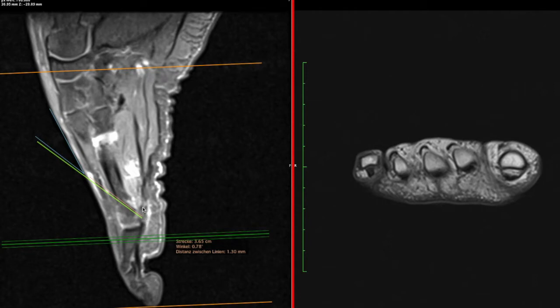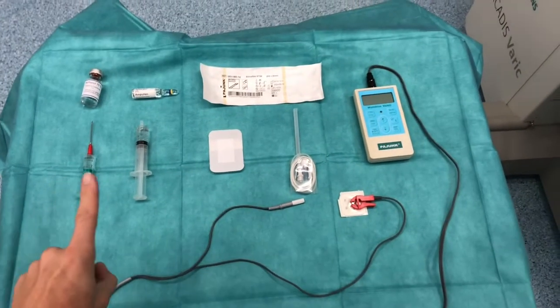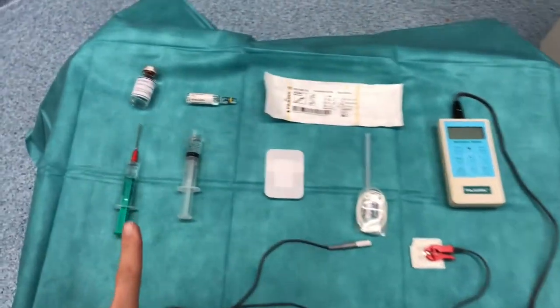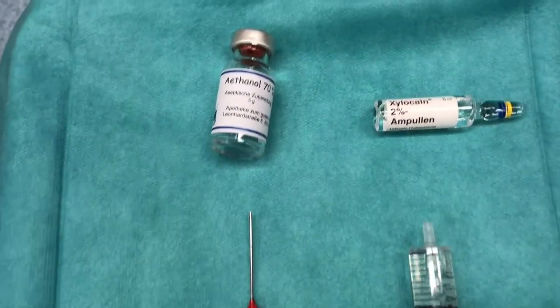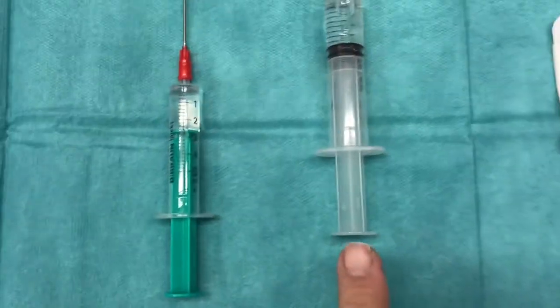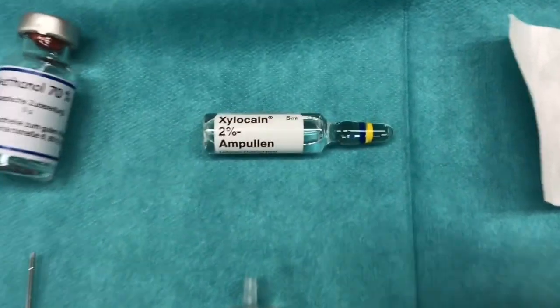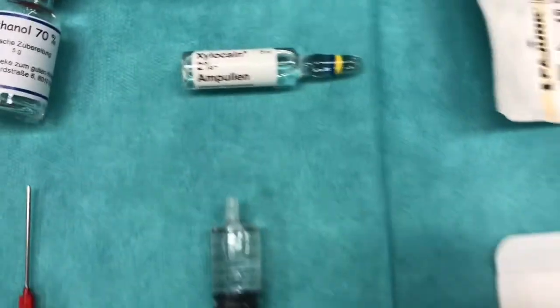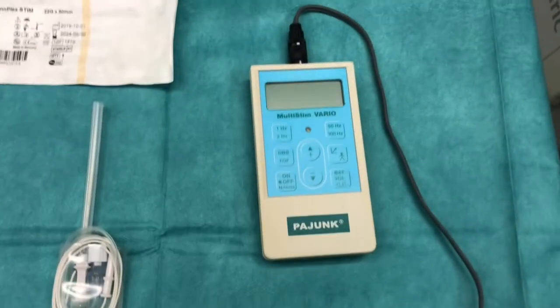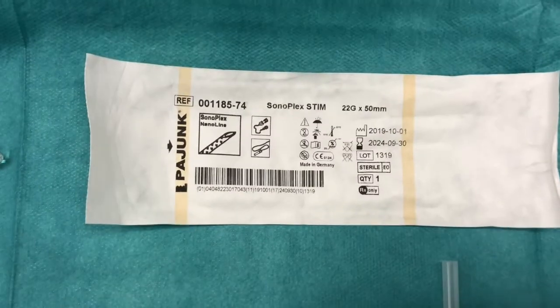As mentioned, I rather inject a little bit proximally. This is everything you need. I take 2.5 ml of ethanol 70% and after the alcoholization I inject 3 ml of xylocaine 2%, and this is my electro-neurographic device and I use a 5 cm 22 gauge needle.